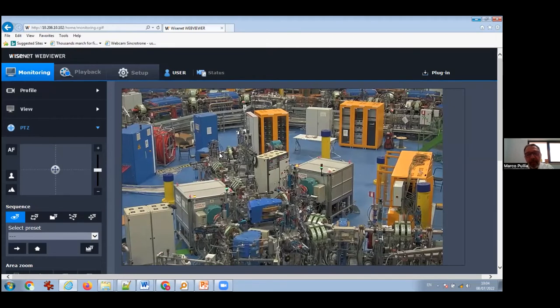And you see here a new beam line, unluckily without a source for the moment. Here you see the solenoid that is in front of where the source will be, and here there is the space for the new source, which is going to be installed shortly, hopefully. The source is in an INFN building 1 kilometer away from CNAO, and we are waiting for the authorization to bring it in, and then we can start the commissioning, of course. So we have the 2 sources, the third one virtually here.